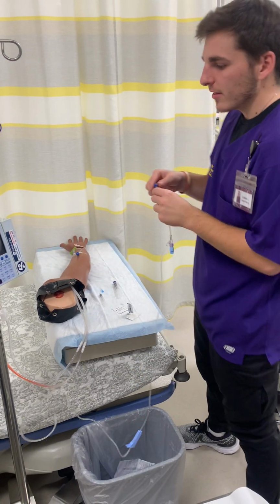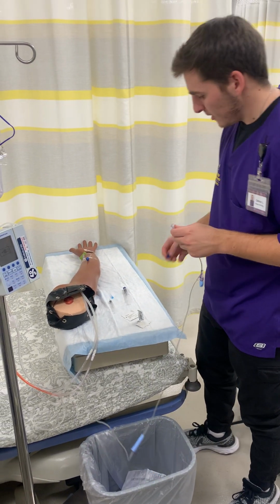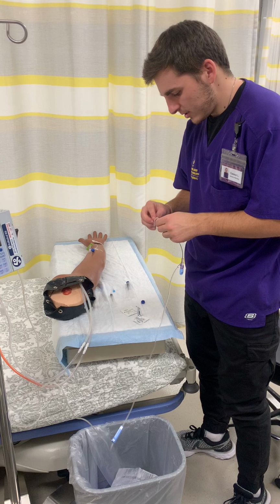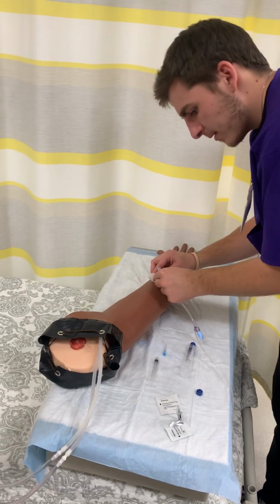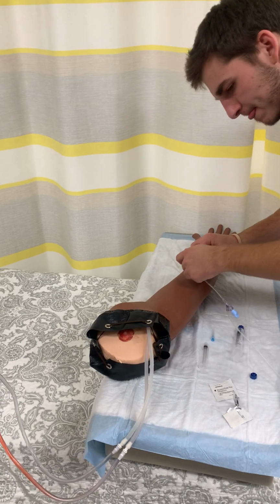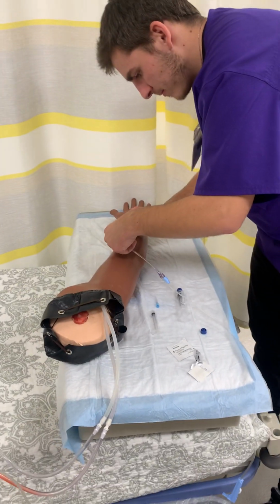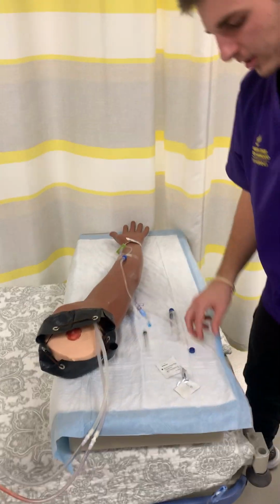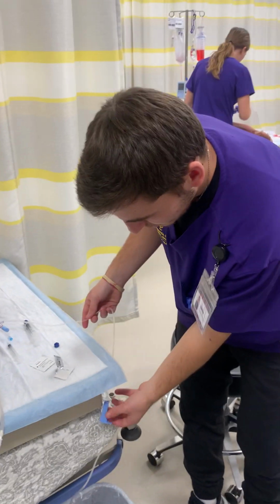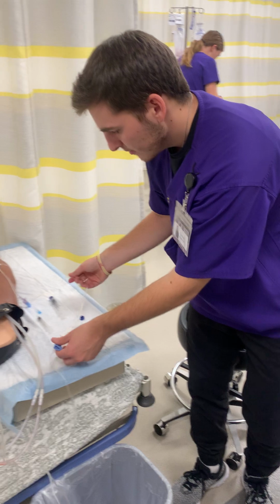Since it's already in the machine, I'm just going to scrub this and insert it. Alright, and I'm making sure that this roller clamp is closed as well.